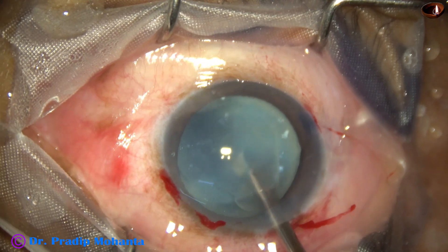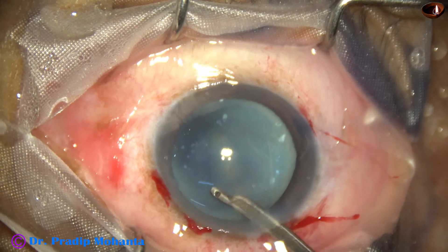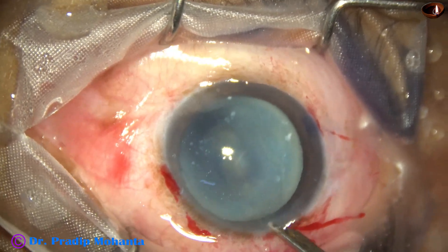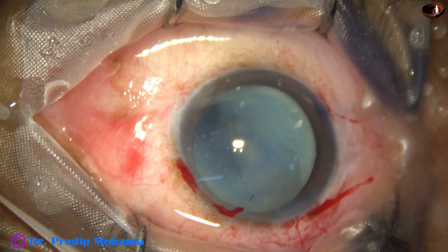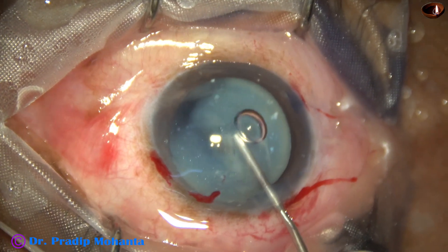I use a Simcoe cannula now to remove most of the liquefied cortical matter. And now I inject Hyalucote again.